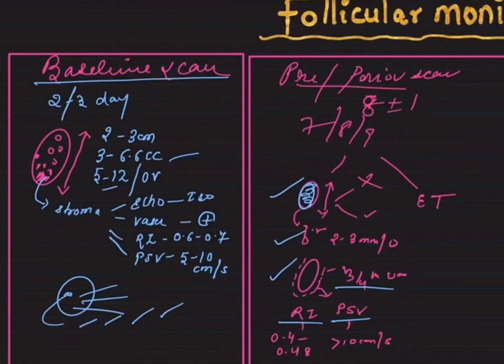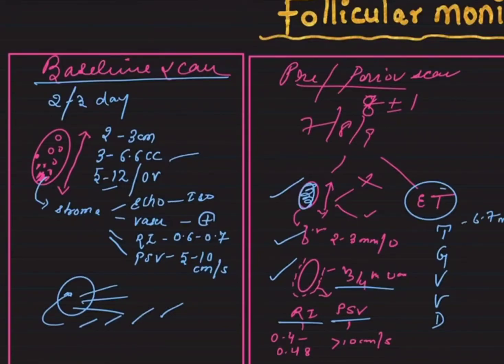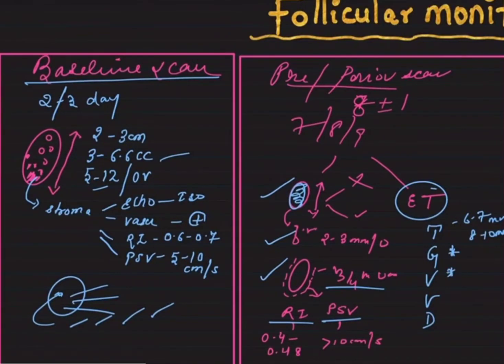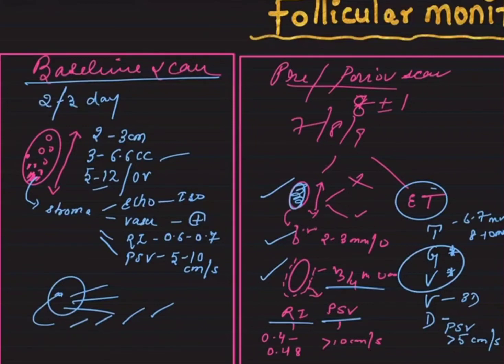The other thing we assess in the pre-periovulatory scan is the endometrium. We evaluate: the thickness — minimally achievable is 6 to 7 mm, with ideal being 8 to 10 mm; the grade of the endometrium; the vascularity; the volume, calculated on 3D ultrasound; and Doppler indices. The PSV of endometrial vascularity should be more than 5 cm/sec.